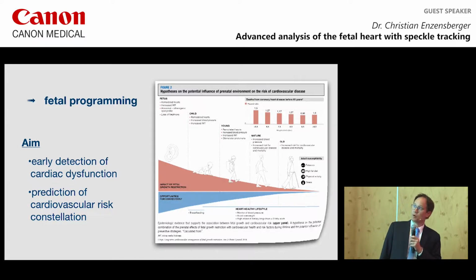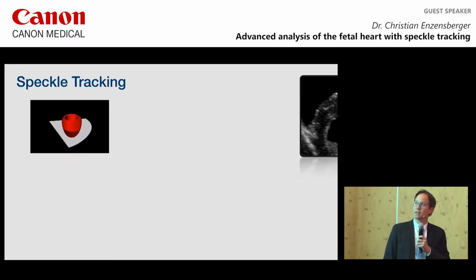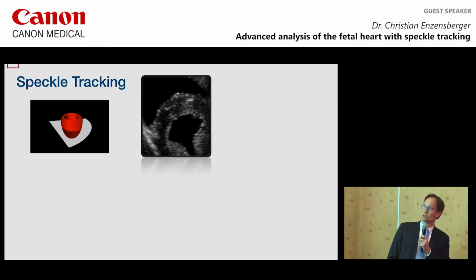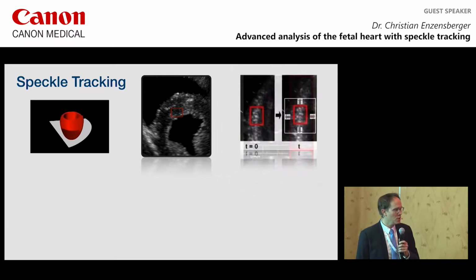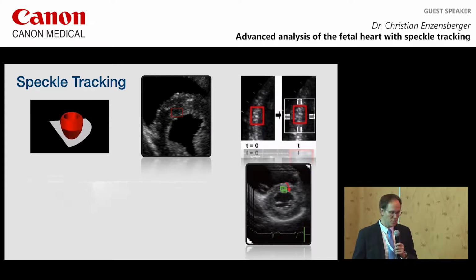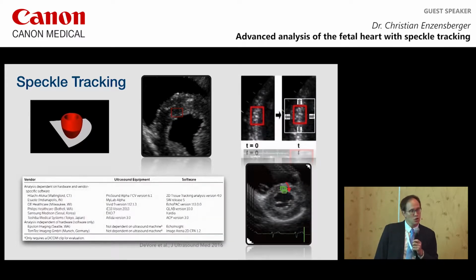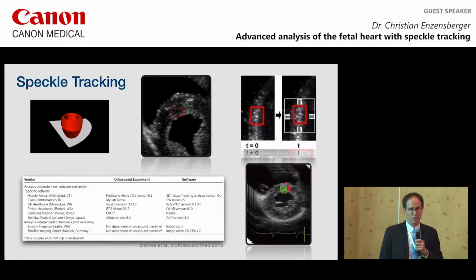Now, the point is, speckle tracking, what is it exactly? Just a short reminder. It's a non-Doppler, more or less angle-independent technique which offers the dynamic investigation of the fetal heart by tracking the myocardium within one cardiac cycle.